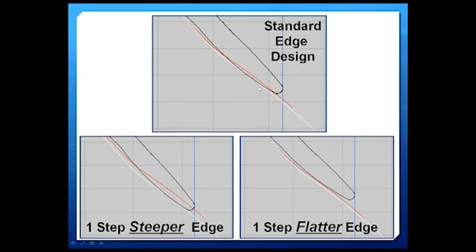And to do that, what you do is you take your standard ICD edge and you create an increased edge lift. That tells the lab to order the lens and manufacture the lens with the tip coming up higher on the surface so that it doesn't sink in and restrict that vessel flow.